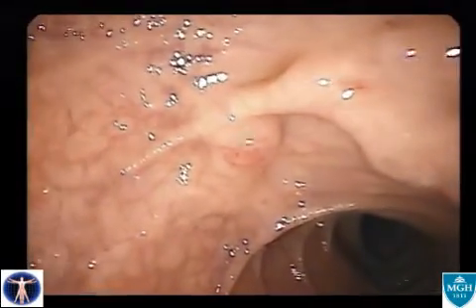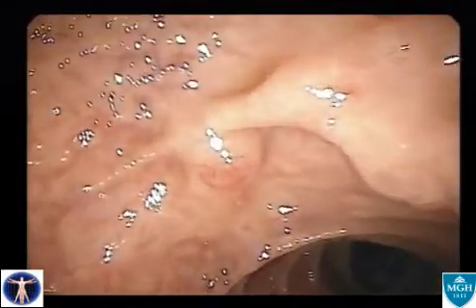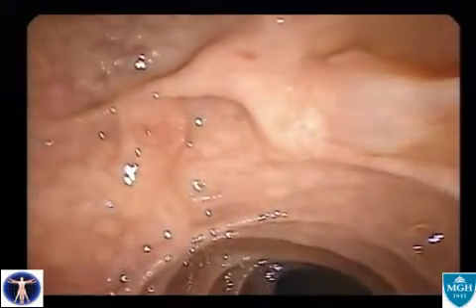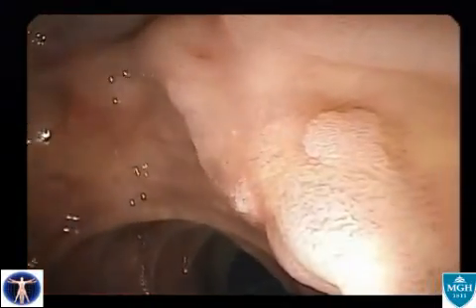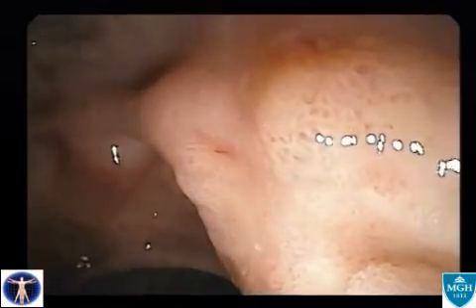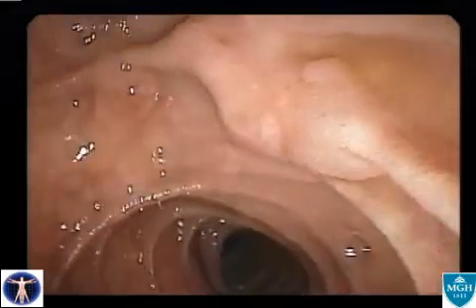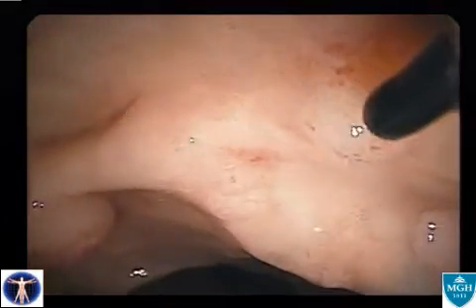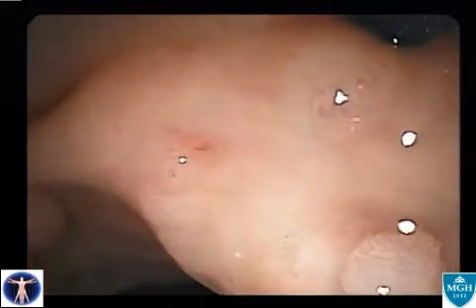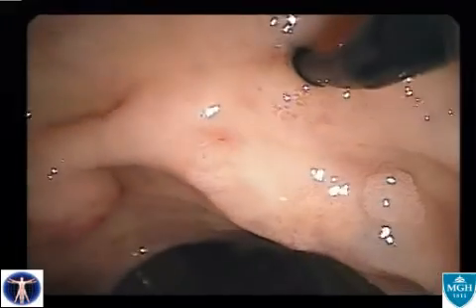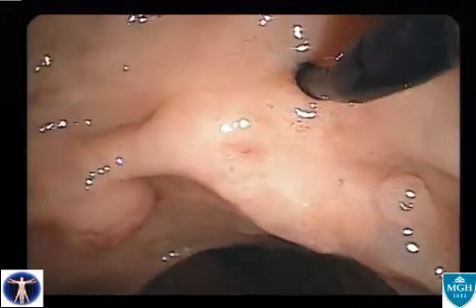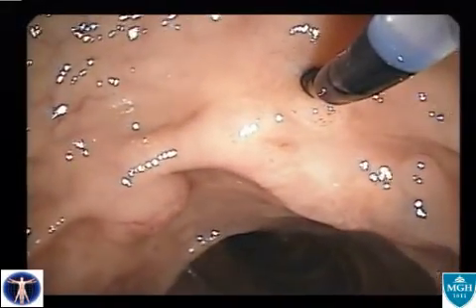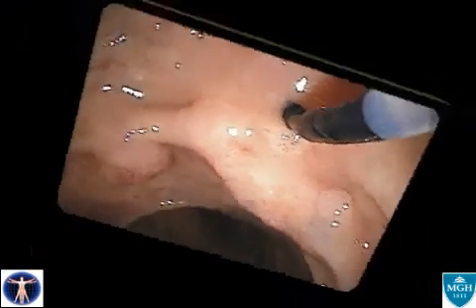Several days later, this study was repeated. Here one can see the normal appearing ampulla, but off to the right are areas of patchy inflammation and erythema. The minor papilla was visualized, and using a taper catheter, the minor papilla was cannulated and the Santorini duct injected.